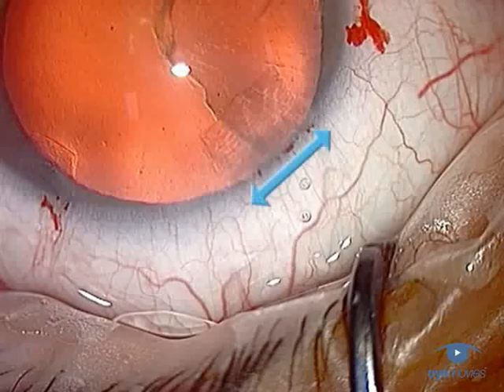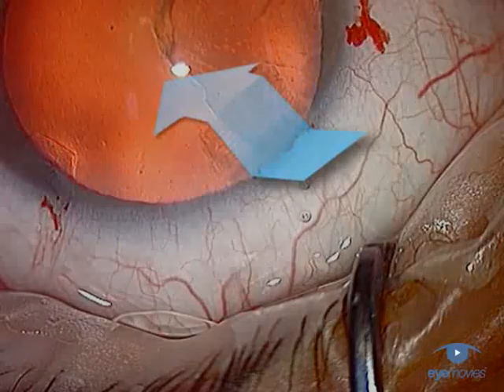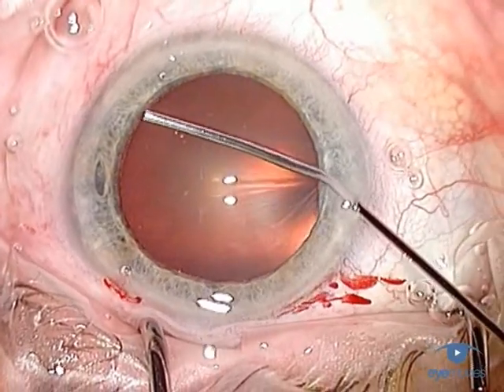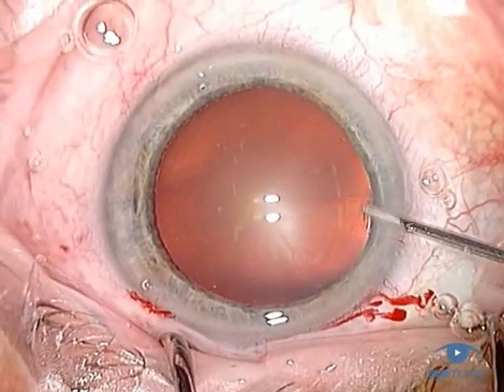Having chosen the type and location of the incision, we now come to its construction. The accurate control of the keratome through the cornea requires a consistently firm eye together with good fixation to give controlled countertraction. You can render the eye consistently firm by backfilling the chamber with viscoelastic through a self-sealing side port.